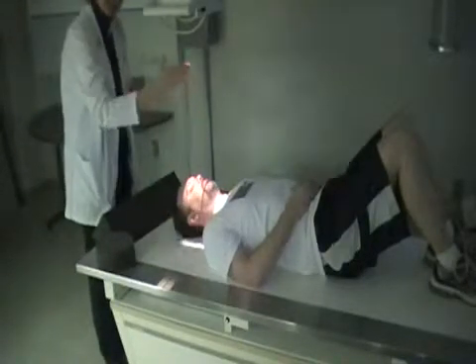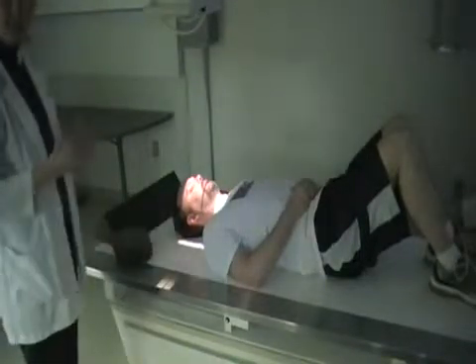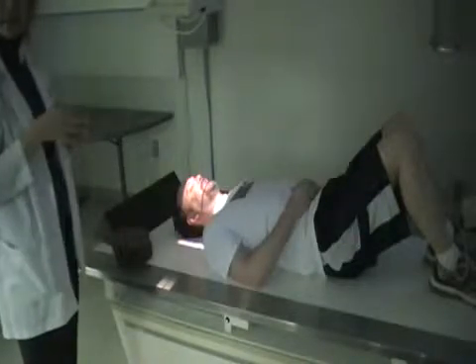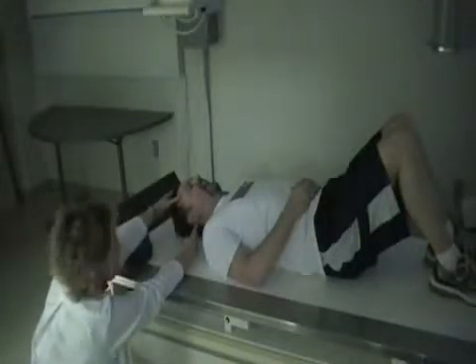We're going to go ahead and set it up so that I'm centered right over the mouth. Now, to see that C1-2 area, I'm going to want to line up the top occlusal plane with the base of the skull or the mastoid tip, because all those are in line with each other. So, have the patient open their mouth. All right, there's his top teeth, and you just make a line from the bottom of those top teeth all the way down. Here's his mastoid tip. So that seems to be in alignment with each other, so that's a good position.